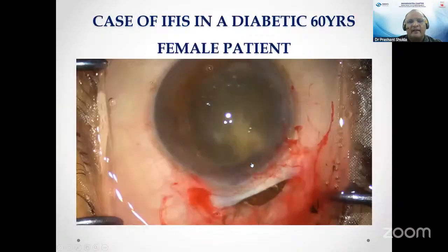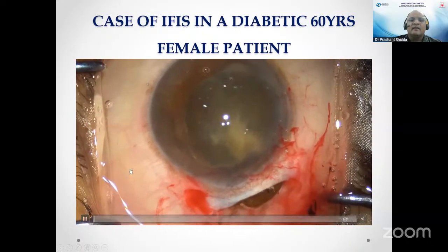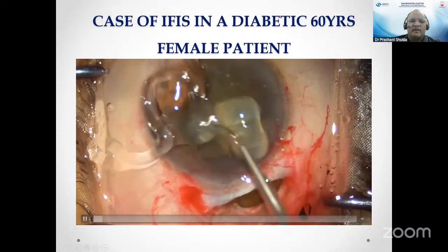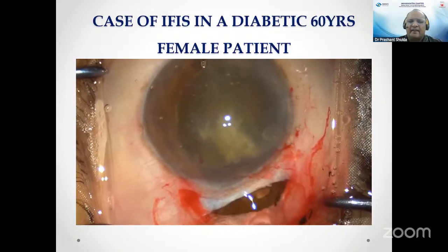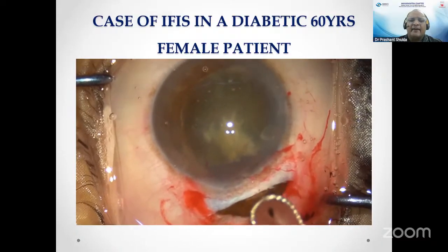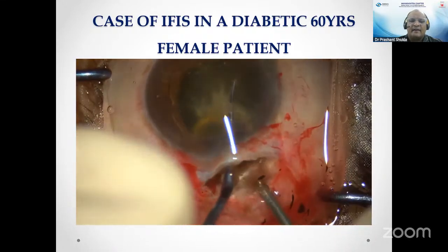There's one more interesting case I have. She was a diabetic patient of 60 years, and after prolapsing the nucleus out of the capsular bag, I had a floppy iris, and it was just coming out again and again. So this was a challenging case, so I thought, let's remove the nucleus first. I tried to put the iris back, but it was not going. So I adopted the phaco sandwich technique to first remove the nucleus and deal with the further steps afterwards.